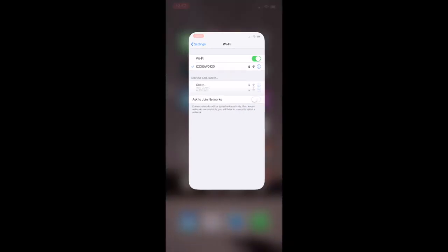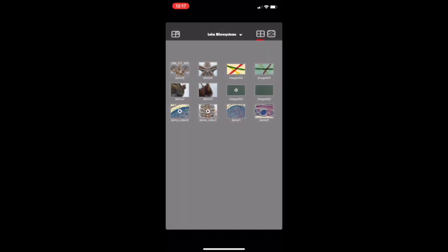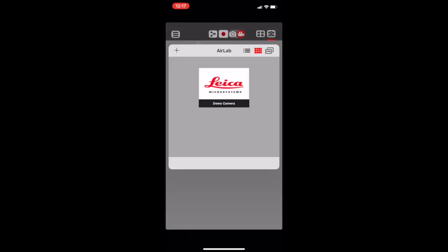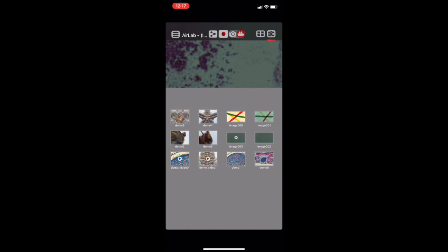Then you're going to go to the AirLab app. Click on the camera icon at the top right corner of your screen. You're going to go to the drop-down menu at the left of your screen and select the camera with the same serial number. You should see your slide shown in the frame at the top of your screen.